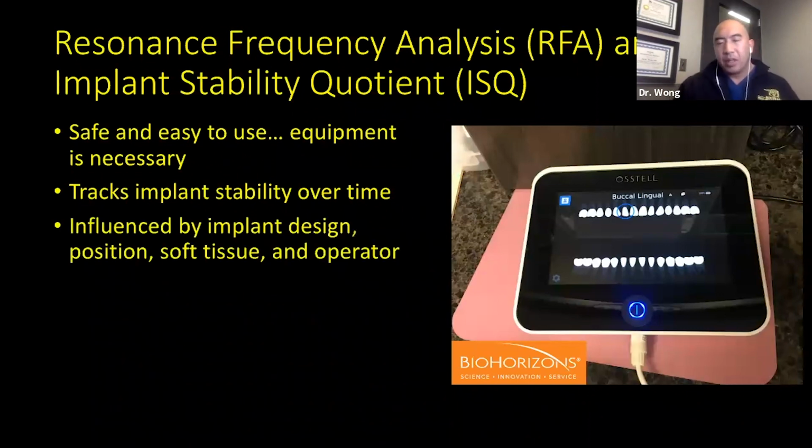So the downside is that this machine behaves a little bit differently depending on the implant design, the position, angulation, the depth of the implant, whether or not there's soft tissue bunched up around the implant, and of course the operator, how you angle the probe.